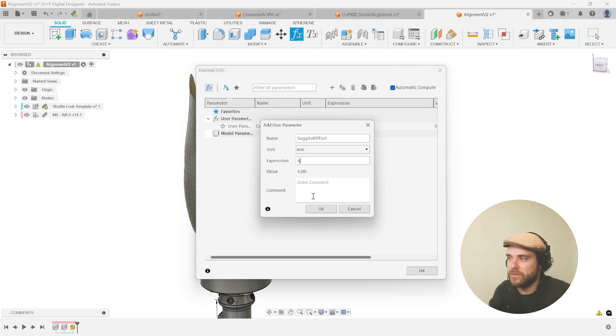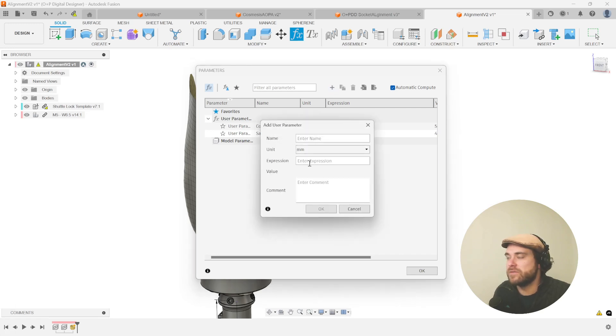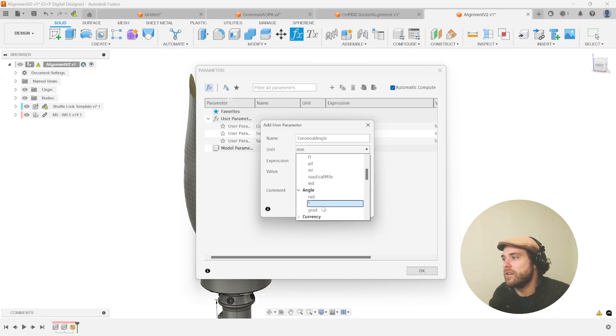Let's do the sagittal angle next, for sagittal angle correction. This is going to be a different unit type — degrees — and let's enter an expression of five, again something that isn't zero to start. Let's do another one for the coronal angle.